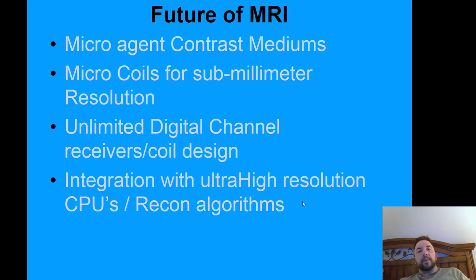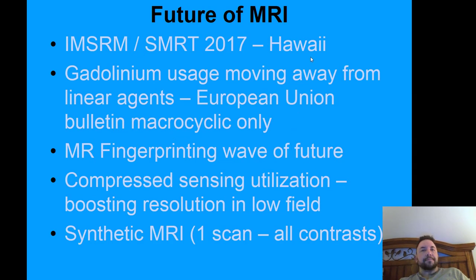High resolution CPUs and recon algorithms. Gadolinium usage moving away from linear agents. The European Union Bulletin says macrocyclics only. MR fingerprinting is the wave of the future, basically setting that component and going from there. Compressed sensing.